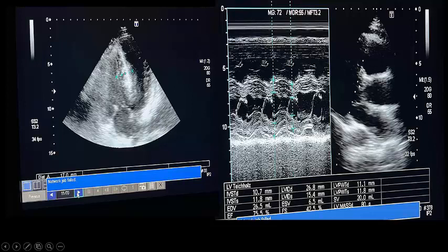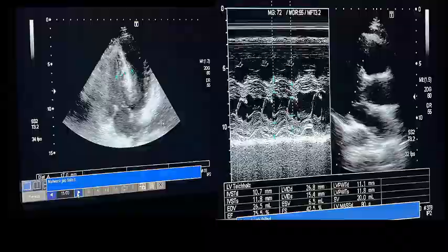It's okay, ejection fraction, because the problem is not in the left ventricle, it's obstructive shock. But you see the thick wall left ventricle, and this patient really is hypertensive, and he is not treated for hypertension, and she is obese, and these are all risk factors for pulmonary embolism.